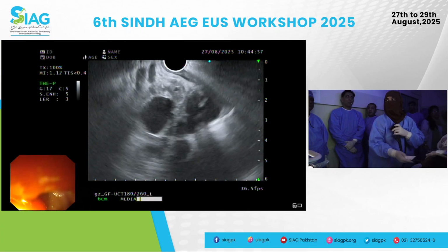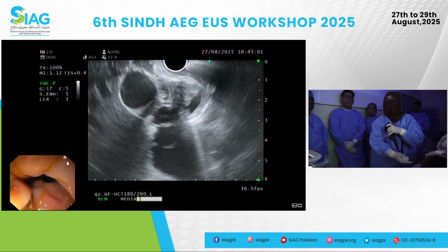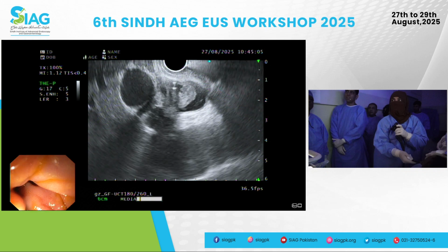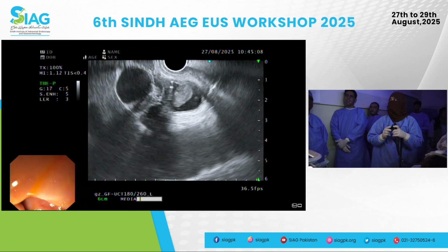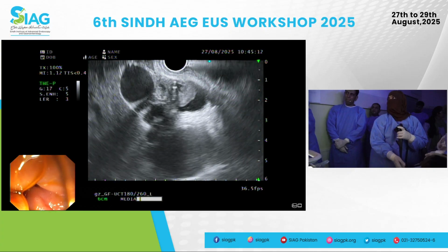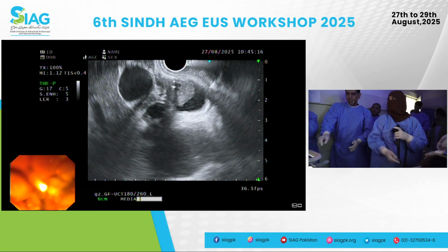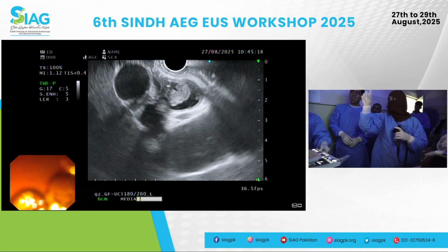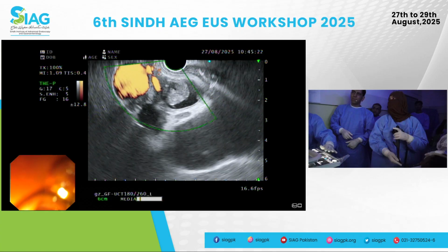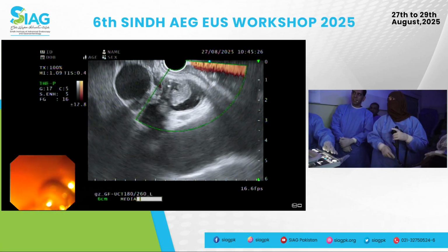Good. So small wheel to the right. Good. You can stay there. I think you're just in the... Definitely some obstruction. Good. So what do you see? Maybe you can stay here and then just sort of... There. What do you see? Probably a vessel. And this one is, I think, the CBD. Good. Excellent. And the CBD with the stent in. This is the portal vein. Good. Portal vein and then the CBD with the stent in situ.